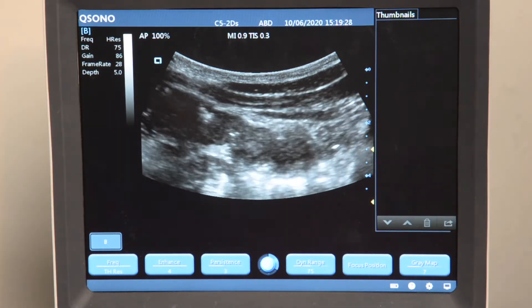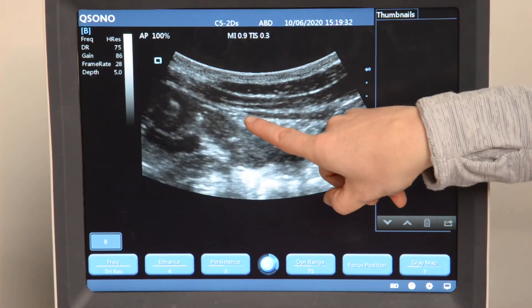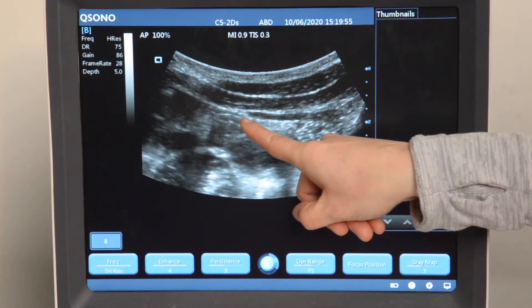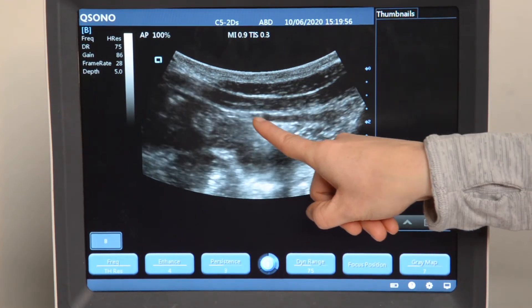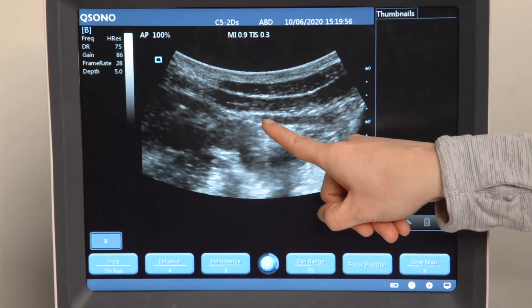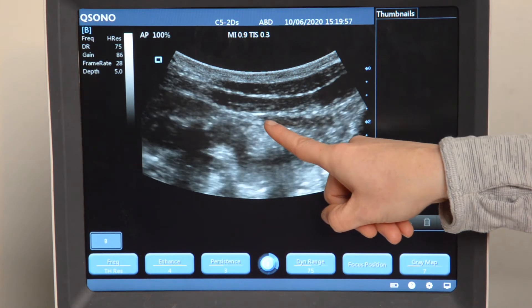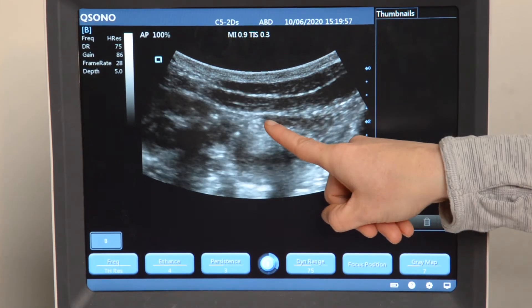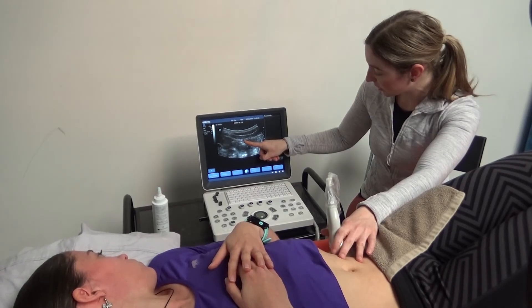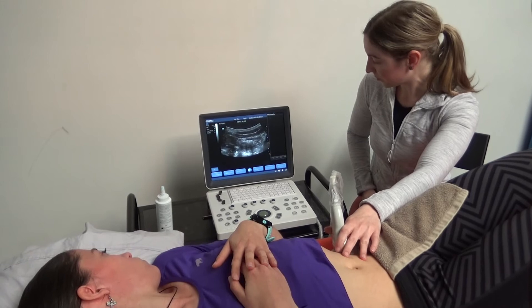To instruct the patient to try and use the transversus, I want you to just slightly pull your belly button in towards your spine. What we're looking for is a slight glide of that transversus where it attaches to the fascia here, in towards the belly button, and we're going to see it move across the screen and tighten the fascia at the front of the belly. That's good. And release.